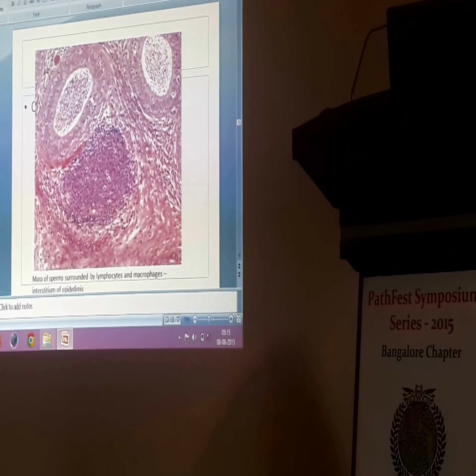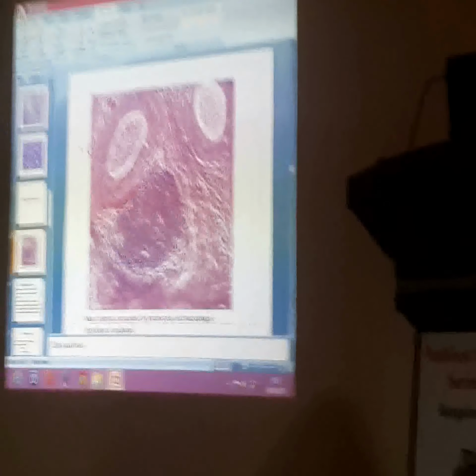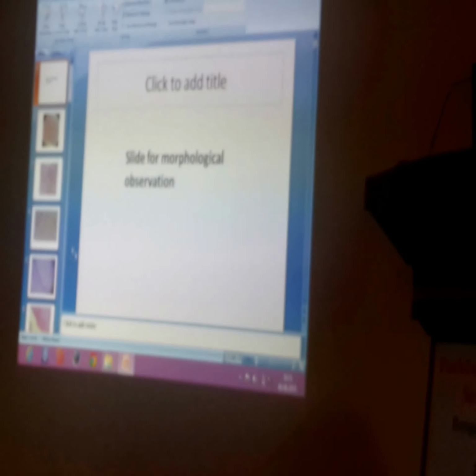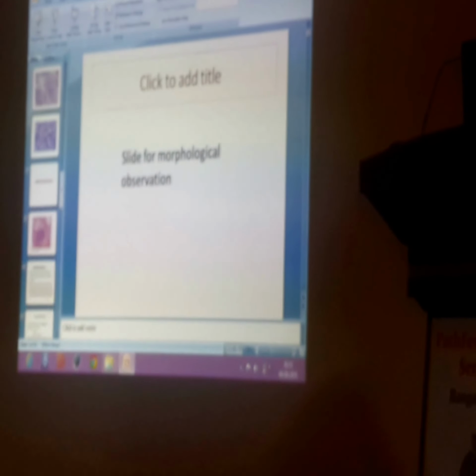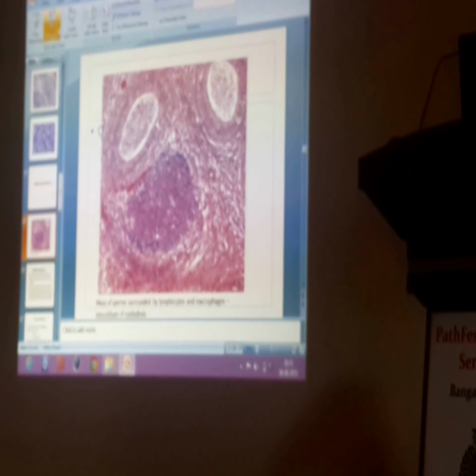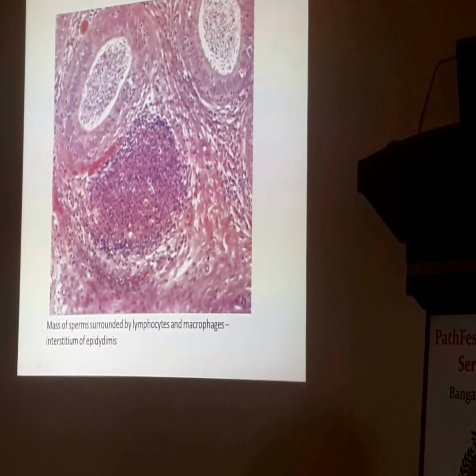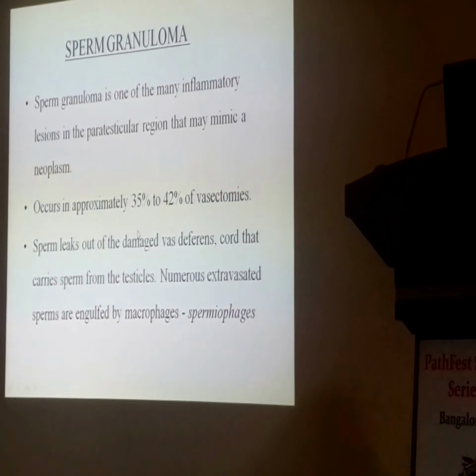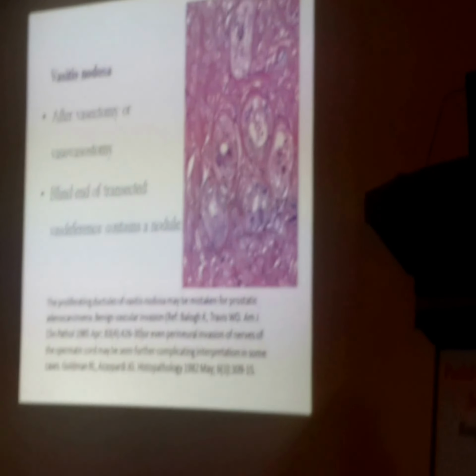What is this? Yes, sir. Any structure you can identify? Okay, that was sperm granuloma.